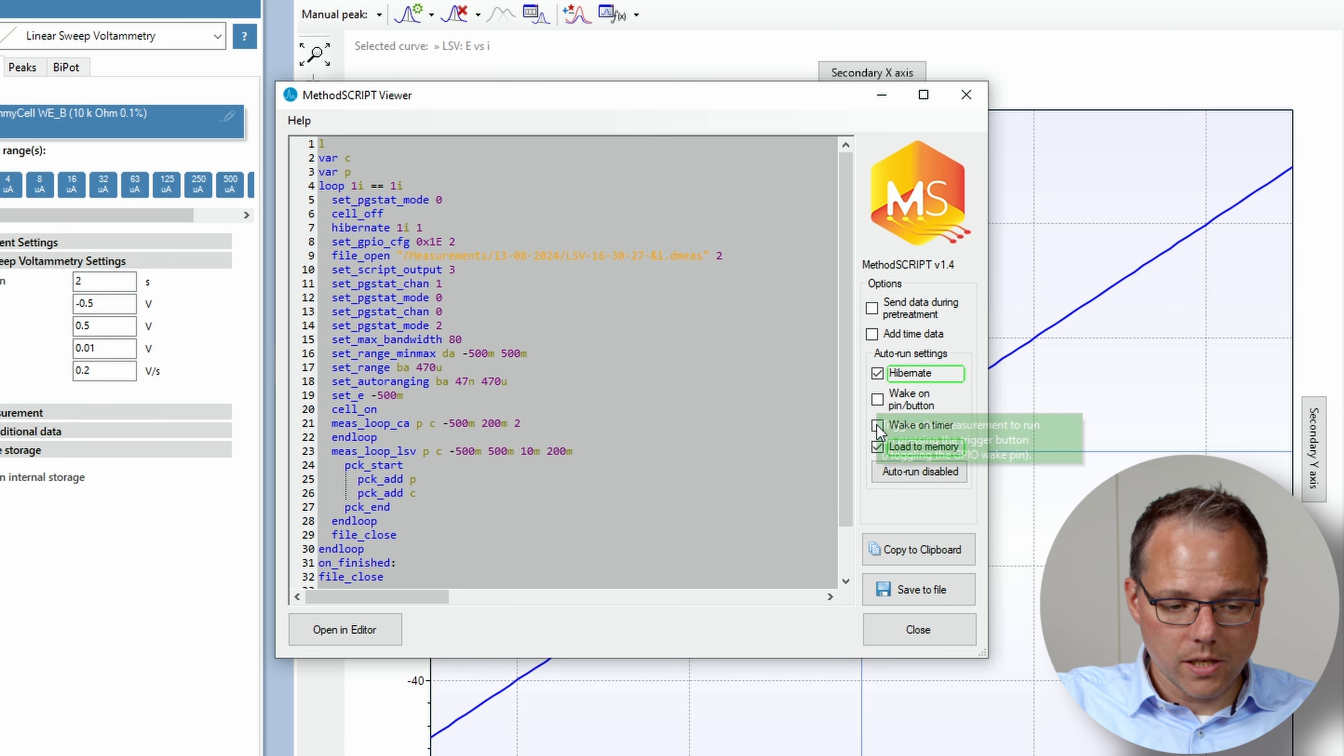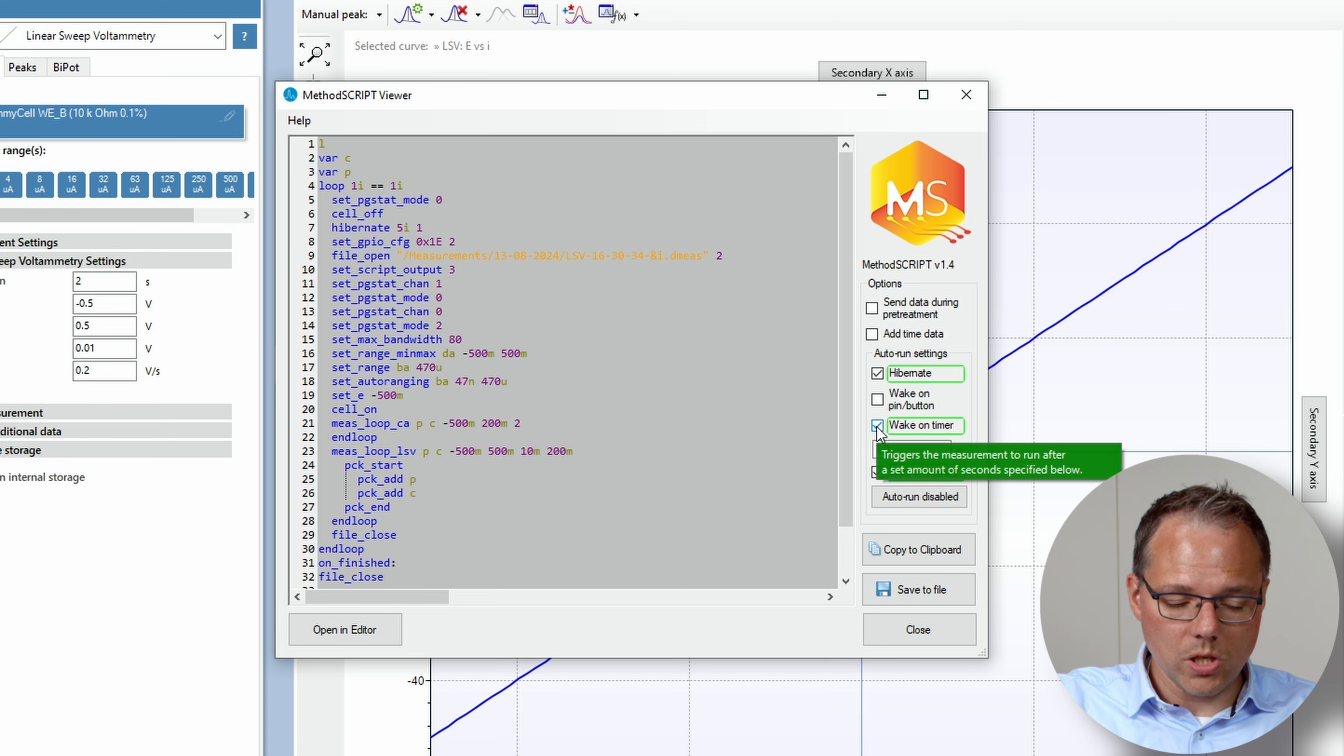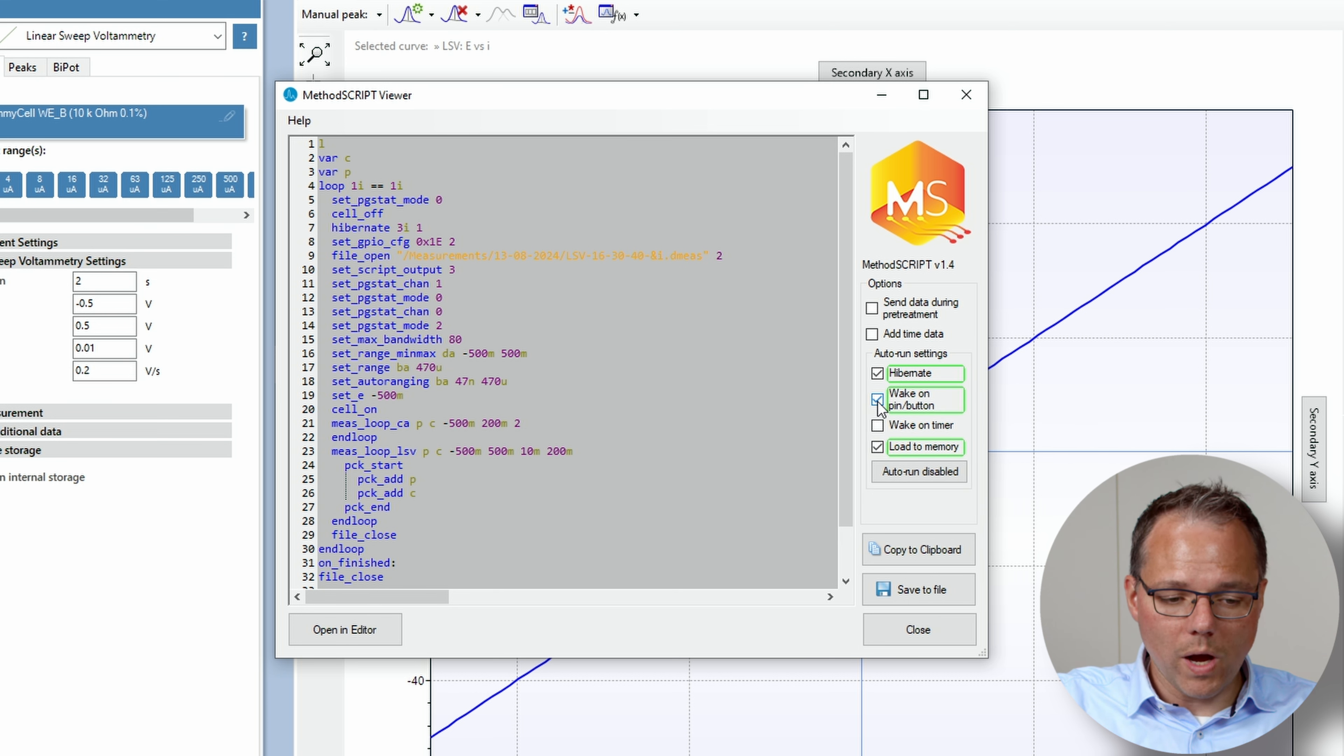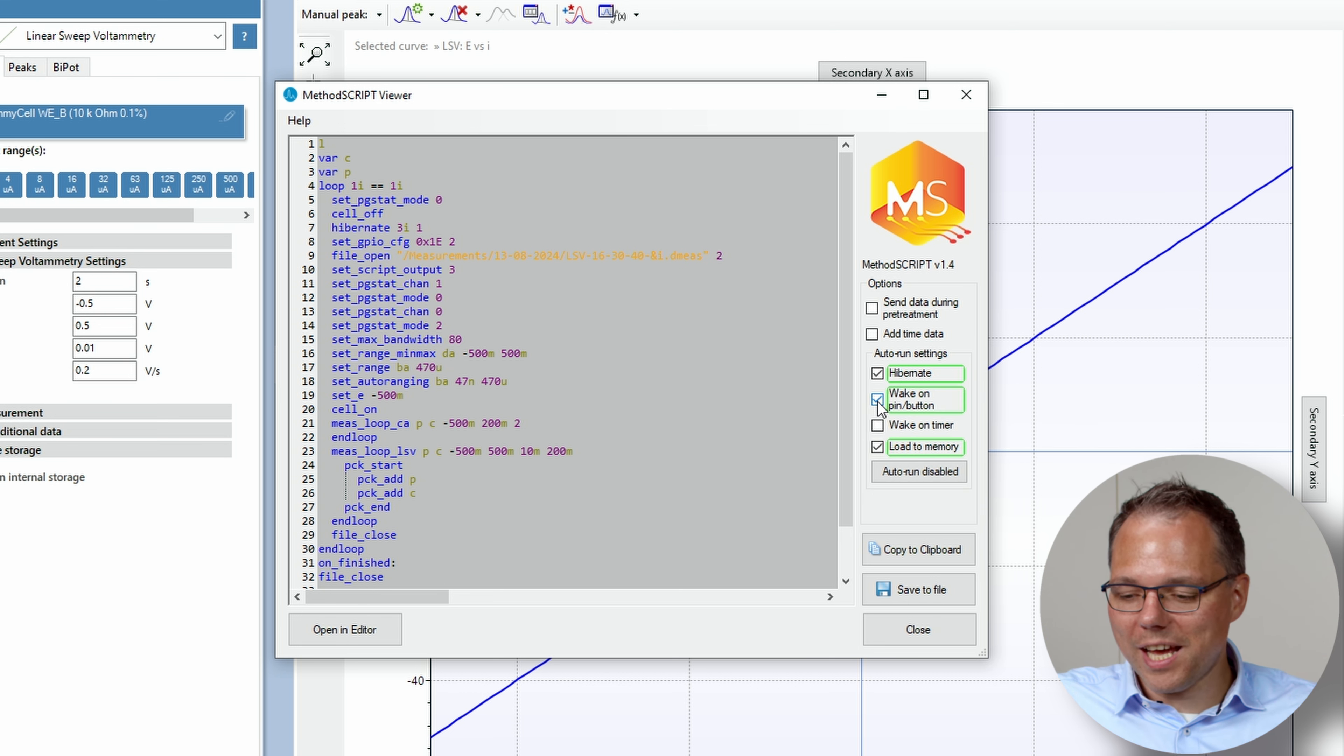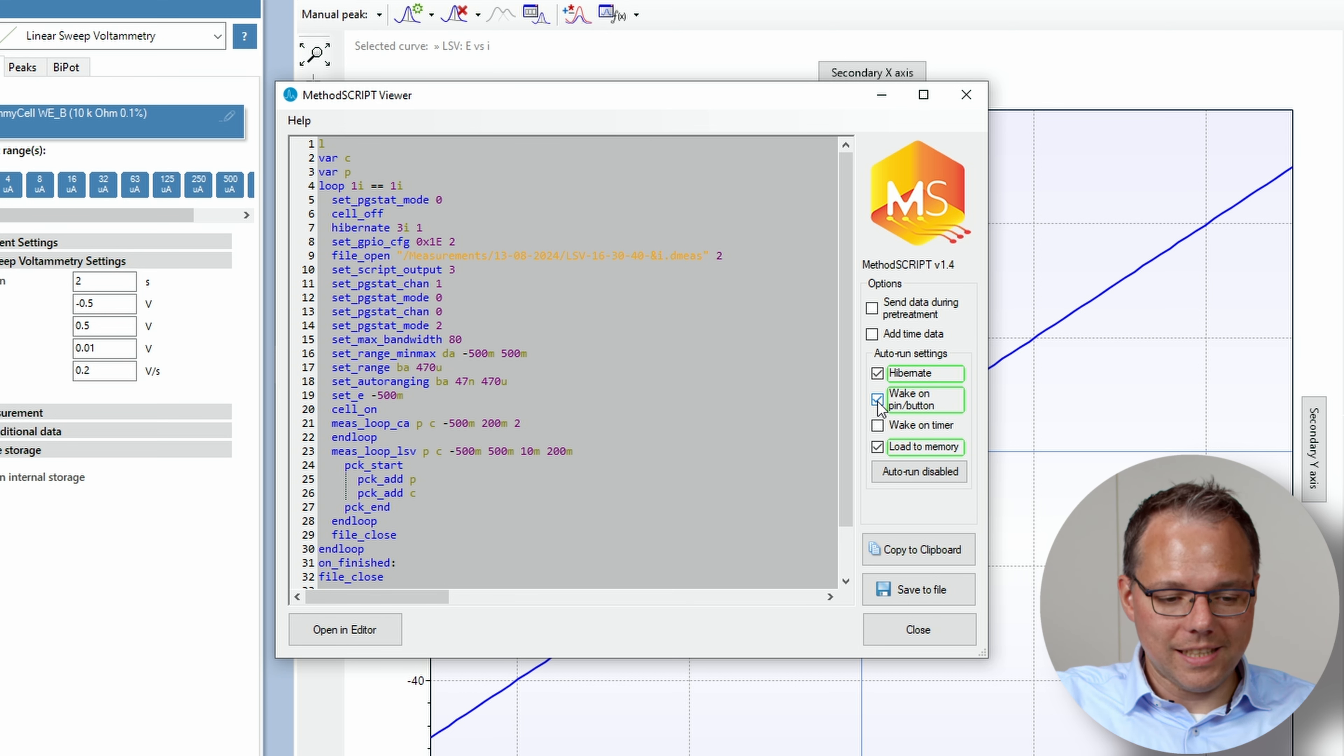One option is just to make it wake up in certain time intervals. That would be this option. Or you can make it wake up every time you press the button on the Sensit wearable. I can easily demonstrate this.